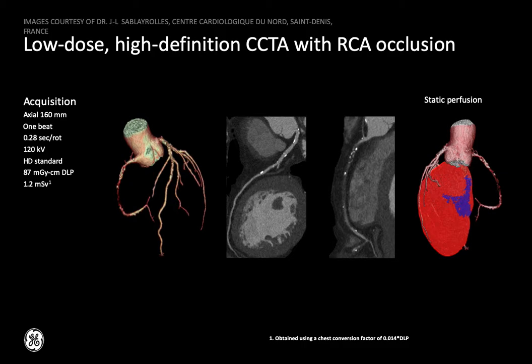So the other idea is that maybe you don't need all of the signal, the whole time course of your perfusion. What if you just make an informed guess and you say, I'm going to take the maximum value? So there's approximations you can make. You know that the background value is always the same. So if really all of myocardium is always 100 units, and what is increasing is the maximum value, you can just take that one value and call that perfusion.